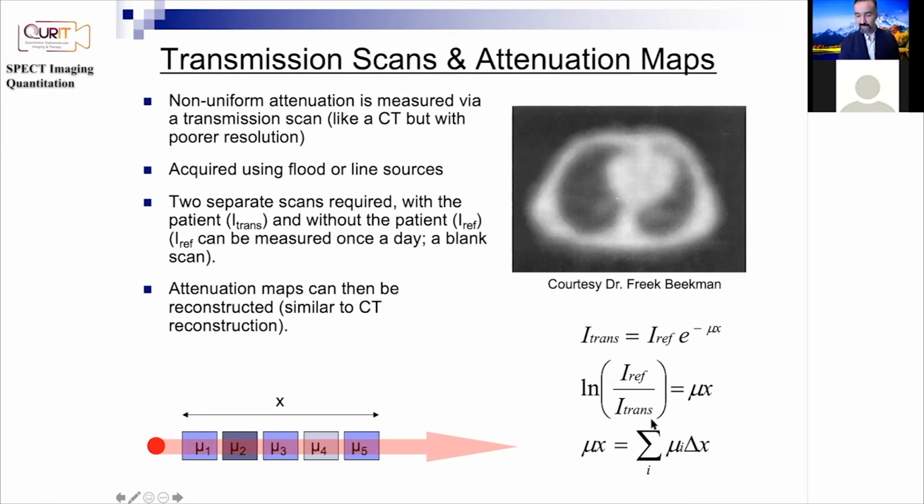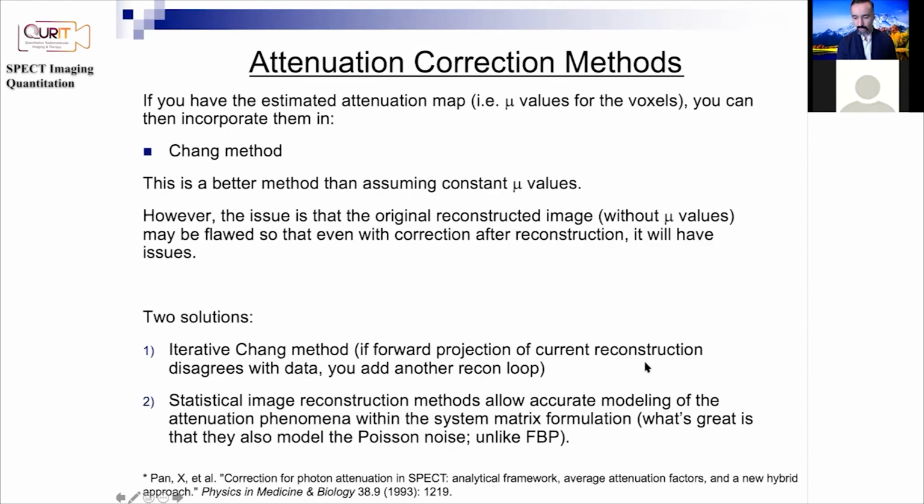So this mu is actually a vector. When we say mu times x, we mean a vector multiplication. So you're doing mu of each pixel, where i represents the pixel number, okay? And so you have this formula.